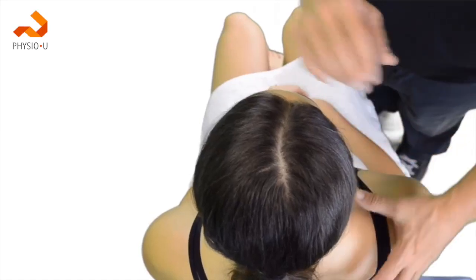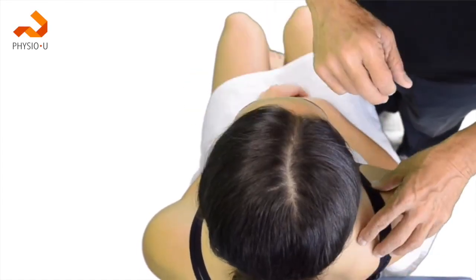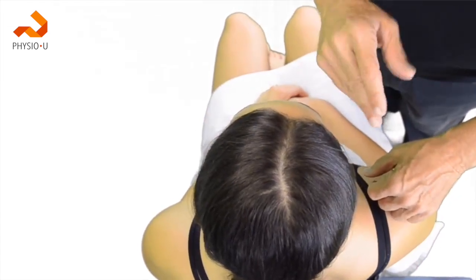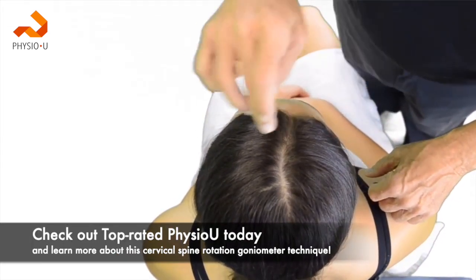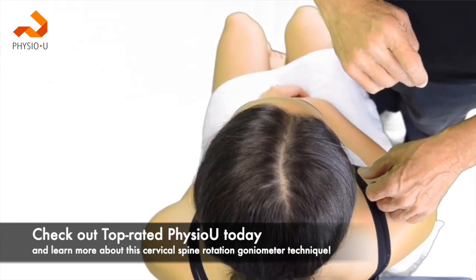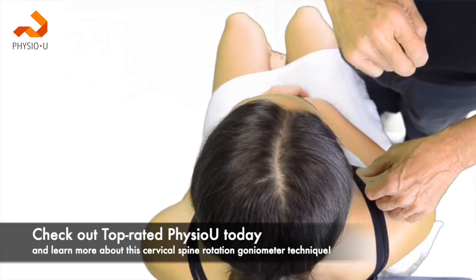In this position, with the patient sitting in upright alignment, we're now going to examine for cervical rotation. When using a goniometer, we need to be directly over top of the patient, as the axis of motion is going to be directly through the top and center of the cranium.